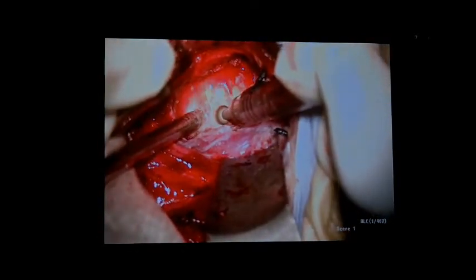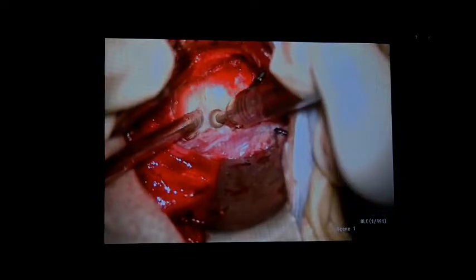It's an old one, and we put in the microscope and the drills. You start using the drills only when you come to the dorsal part of the body. A thin layer is left behind, and then I start off with a cutting burr most of the time, and I think that's Vivek doing this. I don't know if Vivek remembers this, some years ago. And that's of course a diamond burr.